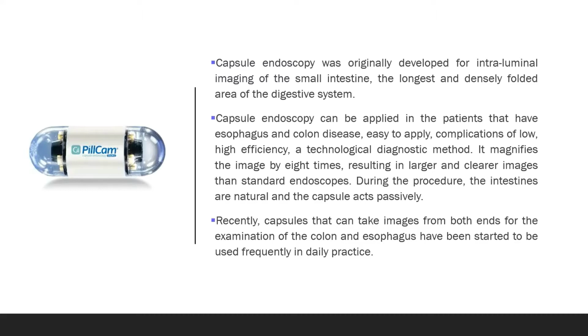It is an easy to apply, low complication, high efficiency, technological diagnosis method. It magnifies the image by 8 times, resulting in larger and clearer images than standard endoscopes. During the procedure, the intestines move naturally and the capsule acts passively. Recently, capsules that can take images from both ends, for the examination of the colon and esophagus, have started to be used frequently in daily practice.